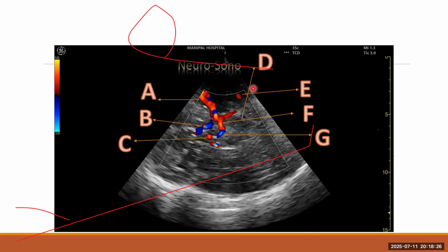So this is not running in a similar way. It's running somewhere posterior, and it is arising probably from this. I have a video further. So these are always posterior choroidal arteries arising from the P1. These are not to be mistaken for your MCAs.